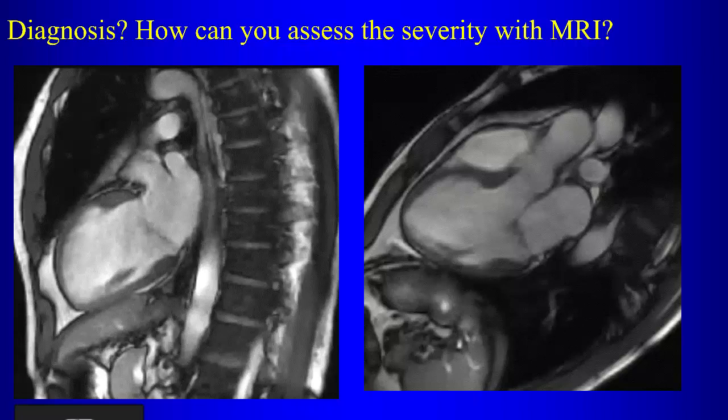That doesn't work, actually, because it's not like the aortic valve, where the ascending aorta is nice and round, and everything goes through there. Here, the mitral valve is more spread out. So trying to measure the jet or the flow directly through the mitral valve does not work well. You can't do that. Use the volumes. So what do you calculate?